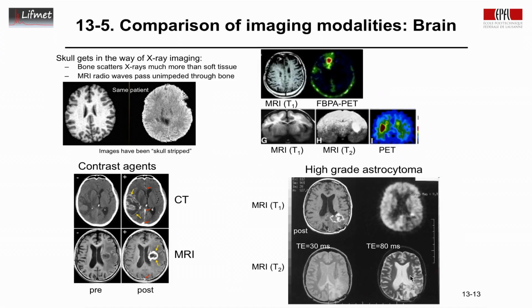While we see here a diffuse hyperintensity all over this area, there is a rim of high uptake of the contrast agent, where the vascularization is. And if one now includes the FDG PET scan, one can see the uptake of glucose at this point. This is the point where the cells are that have a high glucose metabolic rate. They are most likely the cells that one wants to get out to stop the proliferation and the growth of the tumor. Most likely what we have inside here is necrosis, and we can indeed see there's very little uptake of glucose at this point.